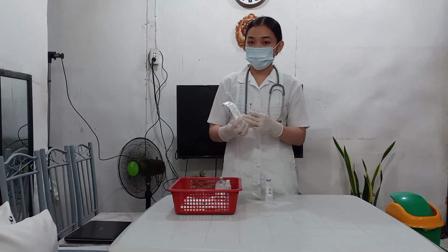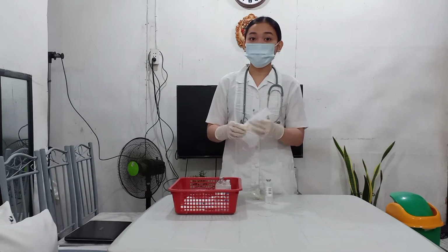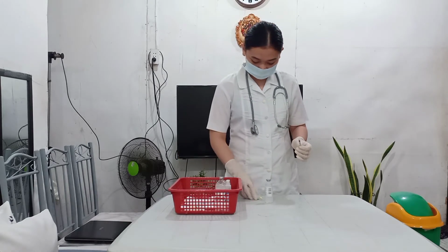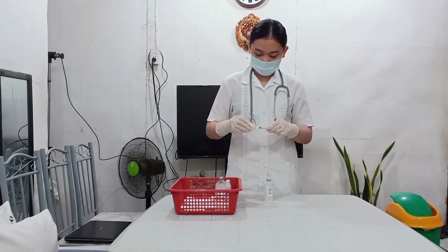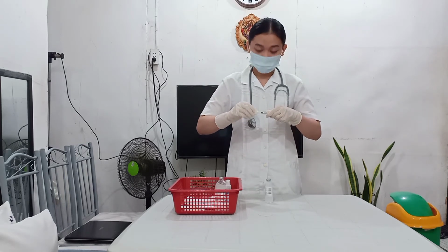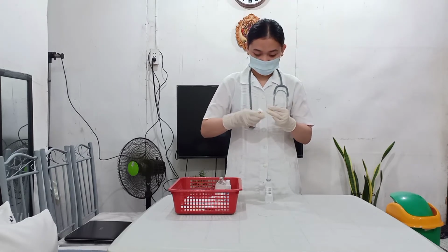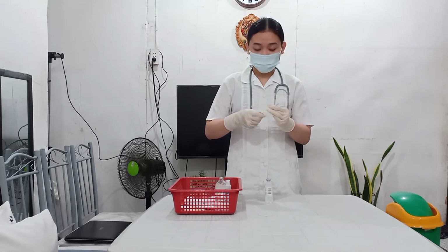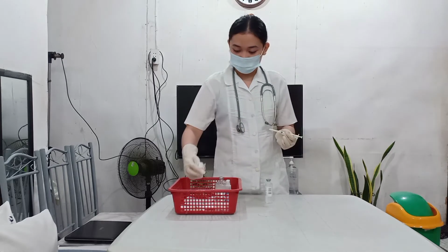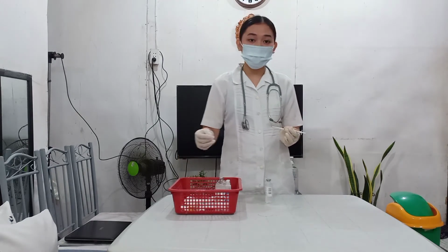We are going to keep this original needle because this will be used on administering the medication later to the patient. So I am already attaching here the filter or the withdrawing needle to my tuberculin syringe. Make sure that it is attached tightly so as not to waste or to leak the medication.